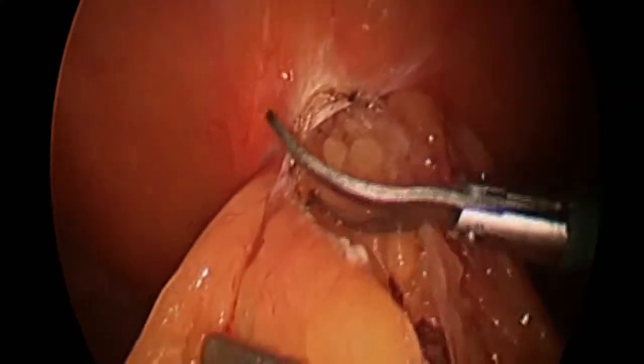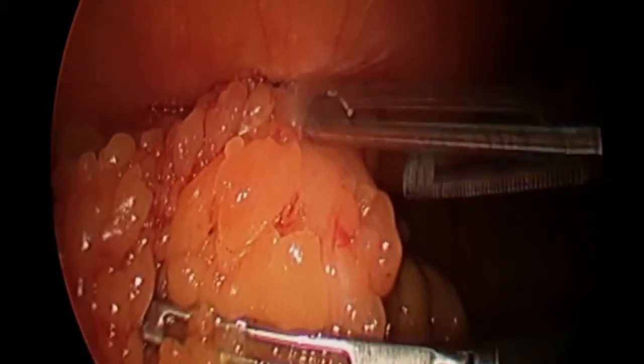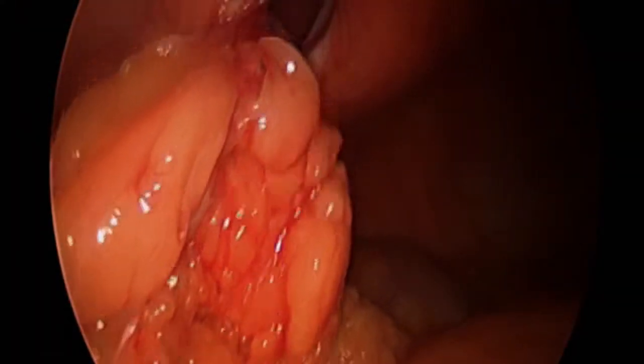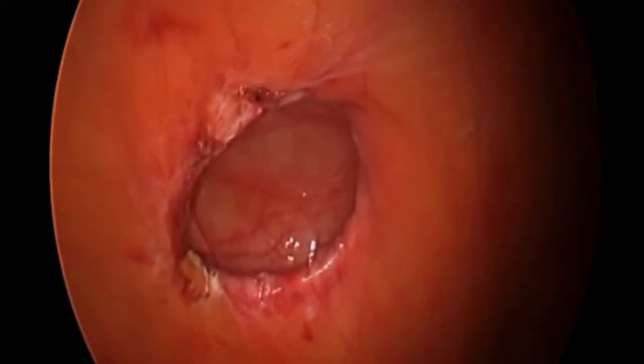We proceed with a diagnostic laparoscopy and upon seeing that the incarcerated component was greater omentum, a decision was made to mobilize, free up, and reduce this utilizing the laparoscopic approach. This minimizes the number of robotic instruments that have to be used and thus helps make this financially more feasible.